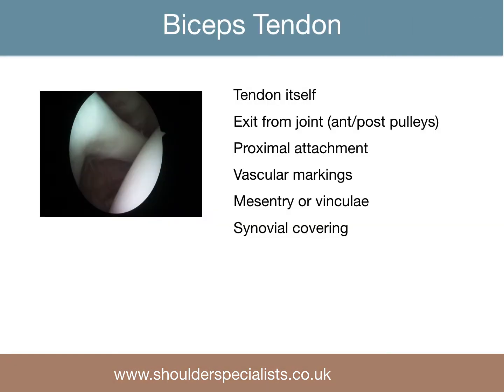When performing the diagnostic routine we often start by visualising the long head of biceps tendon. There are a number of variants seen in terms of the tendon itself, the exit from the joint, its proximal attachment, and its vascular markings and synovial coverings.